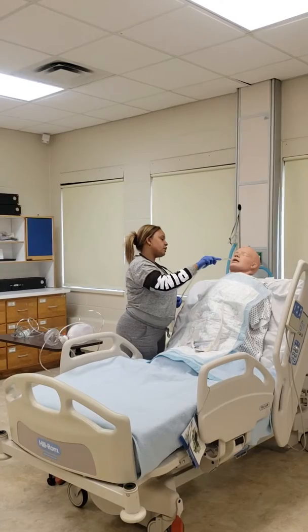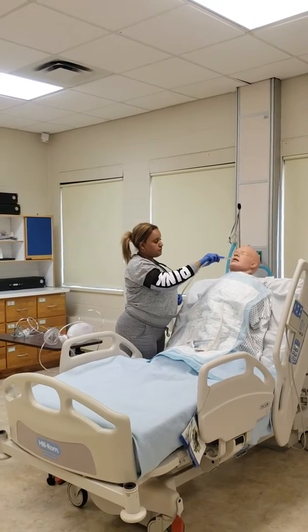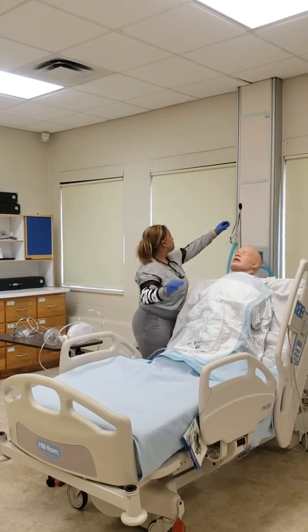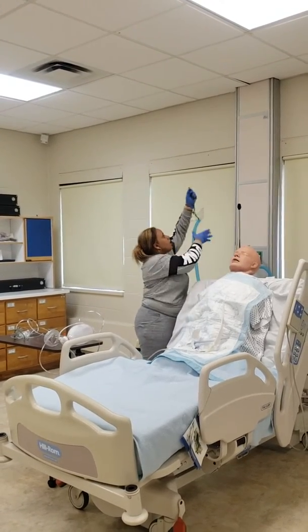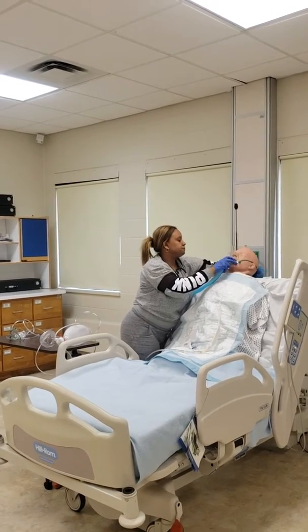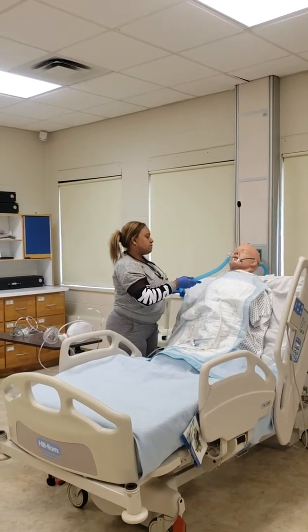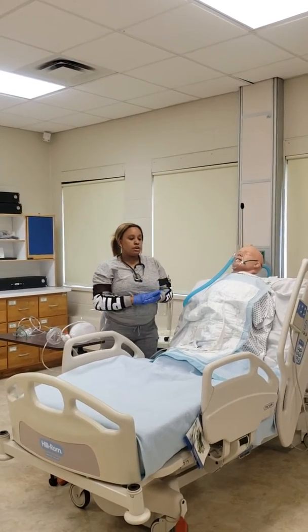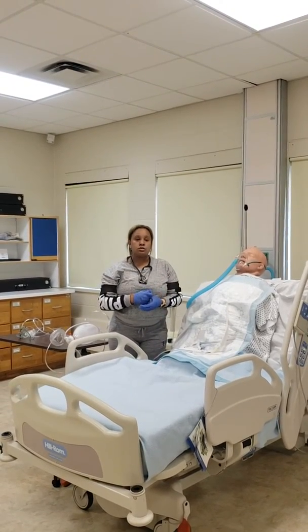All right, keep coughing. I am now going to suction him. Once I am done suctioning him, keep coughing. That's good, you did good. I am going to apply my large volume nebulizer. Once I am done applying my large volume nebulizer, I am going to listen for breath sounds.